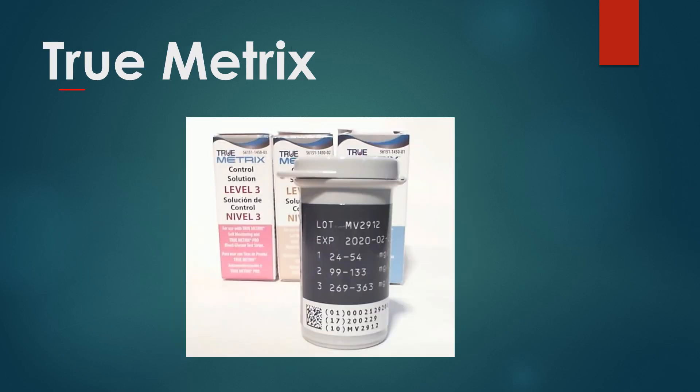True Metrix actually has three levels, as you can see in the background here. That is widely available online and most pharmacies can order the True Metrix control solution. Level one should come in between that range, level two in this range, and level three in this range. So the True Metrix can check three different ranges on the test strips.